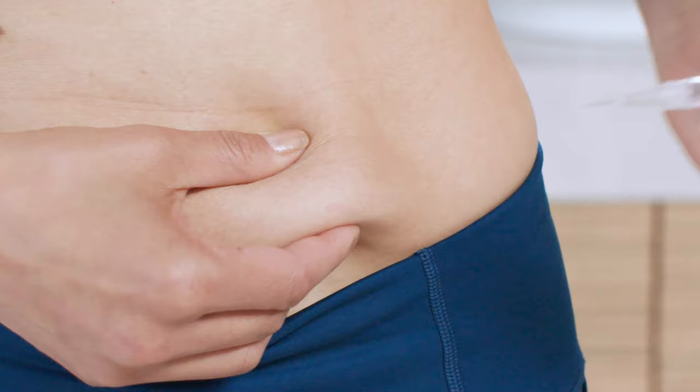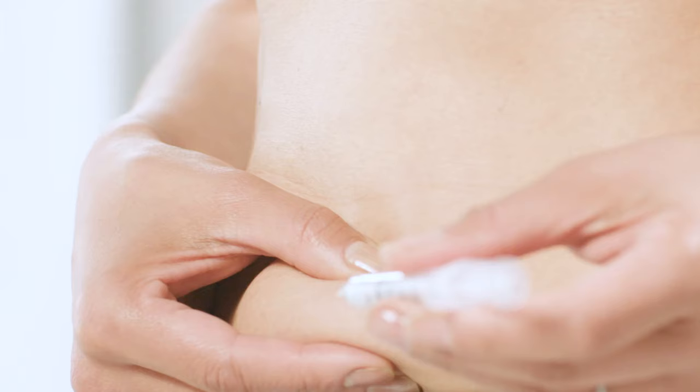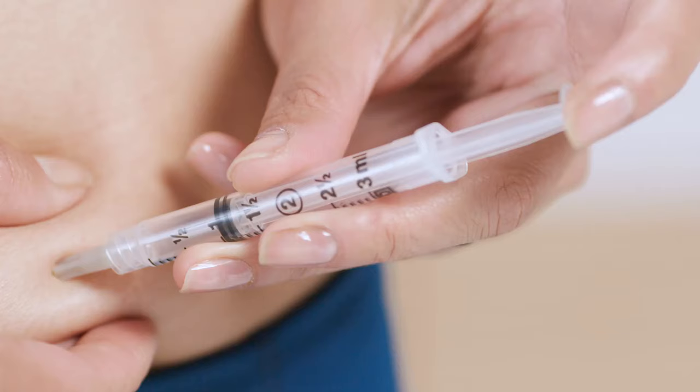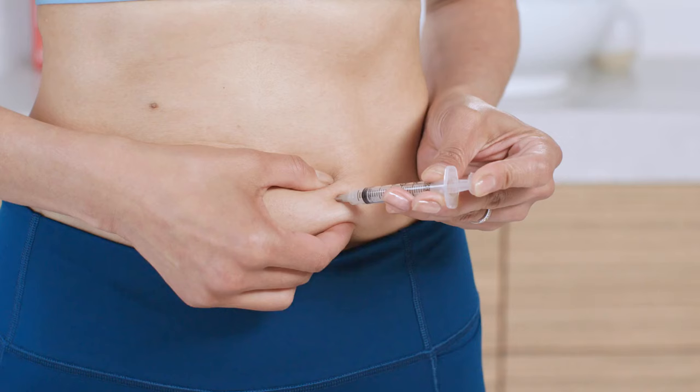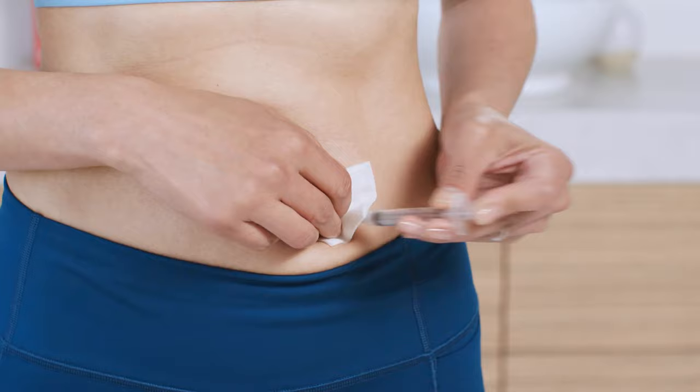Now you're ready to inject the medication, so let's do it. Hold the syringe in one hand and with the other hand, pinch a fold of skin around the injection area. Insert the entire needle straight into the skin at a 45 to 90 degree angle. Slowly push the plunger until you've injected all of the medication. Do a quick count of one, two, three, and then let go of the skin you're pinching. Press down firmly on the injection area with a gauze pad and remove the needle.